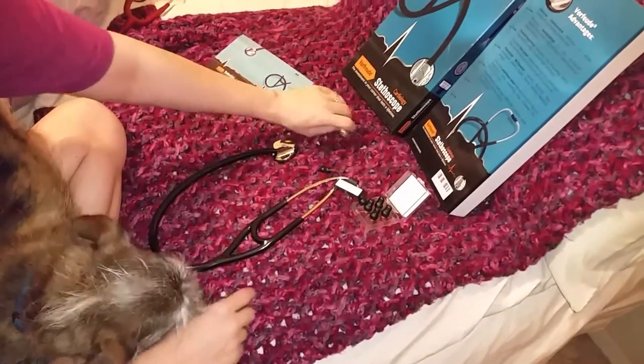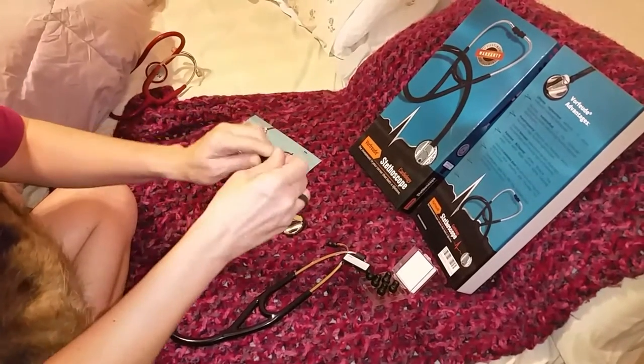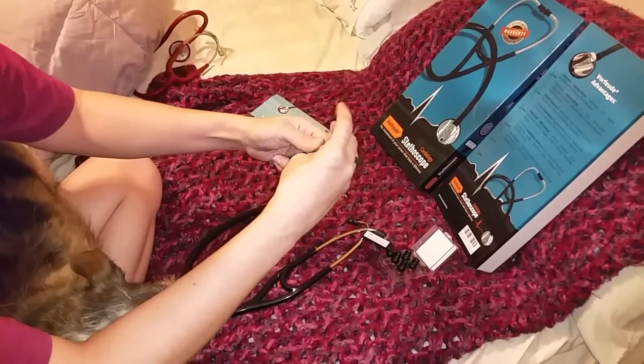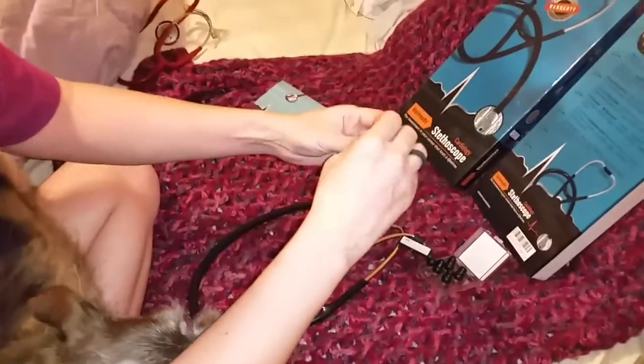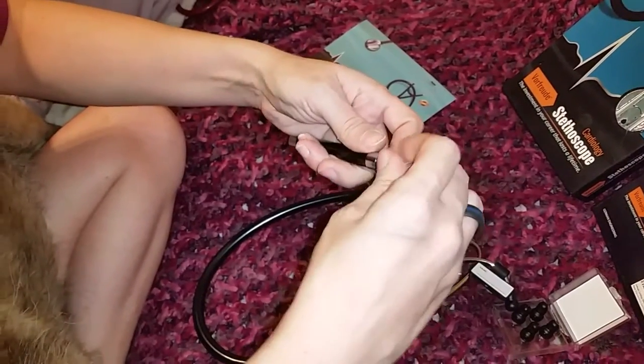It comes with a pen light with the batteries included. To activate it, you just open it up and it has a little piece of cardboard that blocks it. You just pop out the cardboard, then go ahead and put it back in and you'll be good to go.